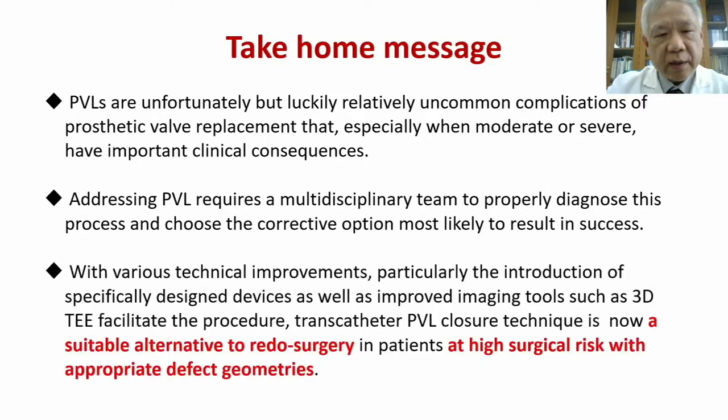With various technical improvements, particularly the introduction of specifically designed devices as well as improved imaging tools such as 3D, which facilitate the procedure, transcatheter PVL closure is now a suitable alternative to redo surgery in patients at high surgical risk with appropriate defect geometries.